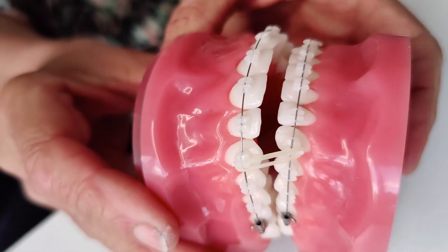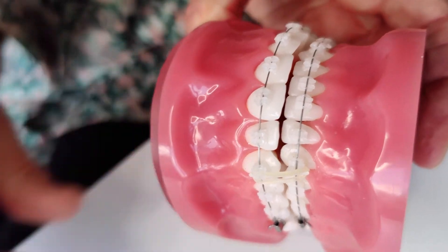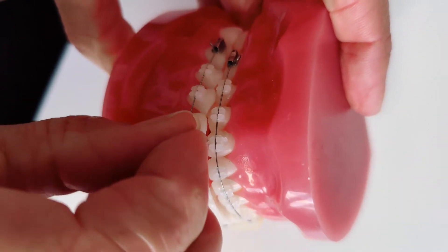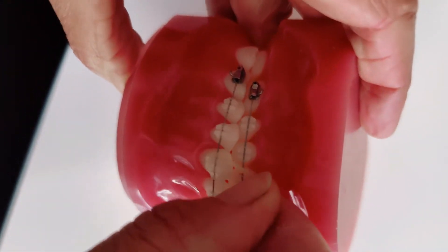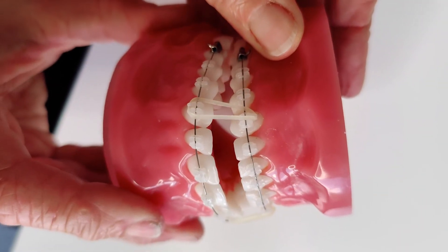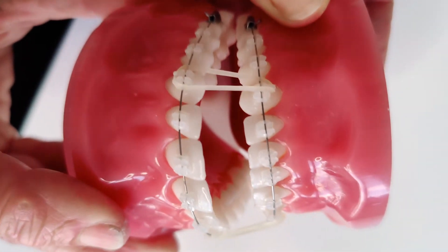I'll just show you how to place these with the elastic on the other side. So it's the canine hook and then down to the lower hook — and these are anterior elastics.